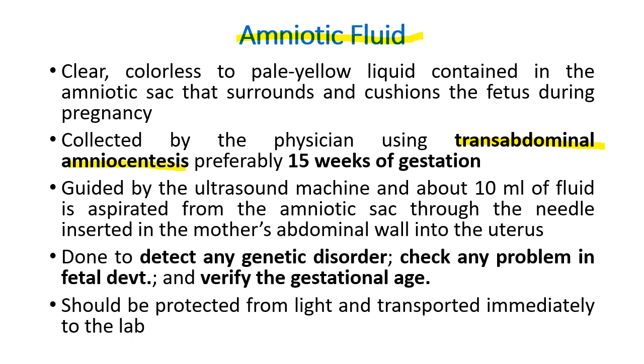So paano to kinokolek? It is guided with an ultrasound machine and about 10 ml of fluid is aspirated. Bakit to ginagawa? It is done to detect genetic disorder, check any problem in the fetal development, and verify the gestational age.